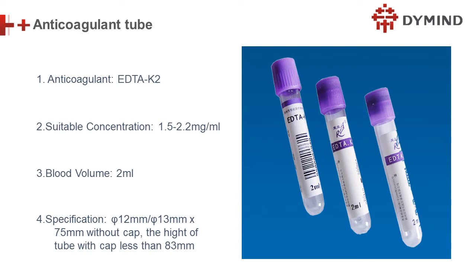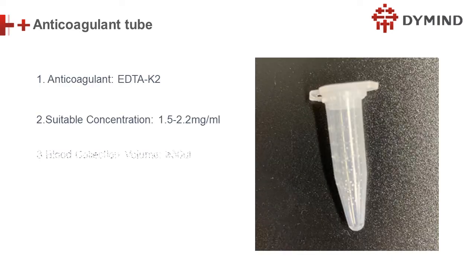No problem. It's no problem. The punching still works. But the best way is we use the 83 millimeter tube. Okay, so this is the tube. Some hospitals don't have the tube.